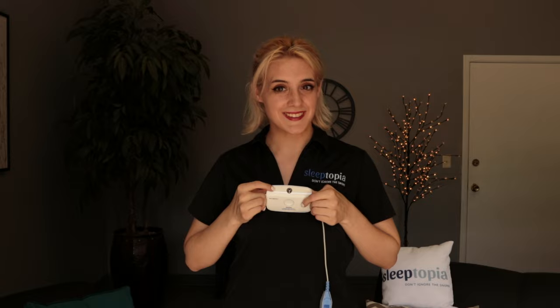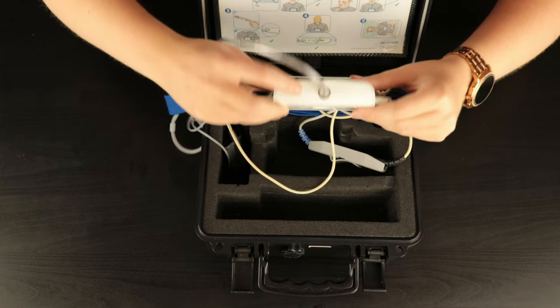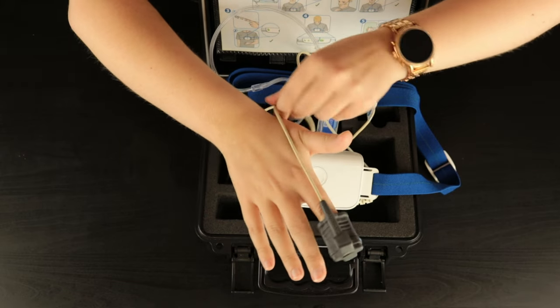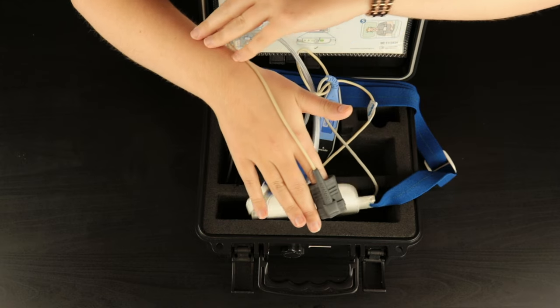Once you successfully connect both ends of the chest belt to your home sleep study device, you'll notice a green light — this is how you know the device is on. You'll notice that there is an SpO2 monitor attached to the device; simply insert your index finger into the probe. You can also use medical tape on the back of your hand to keep the SpO2 probe in place while you sleep.